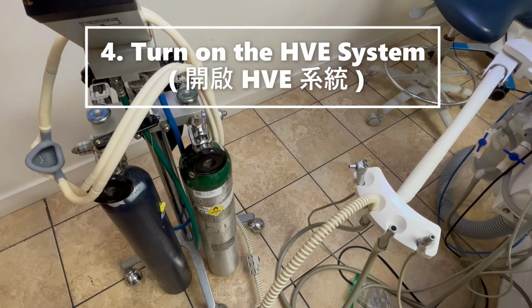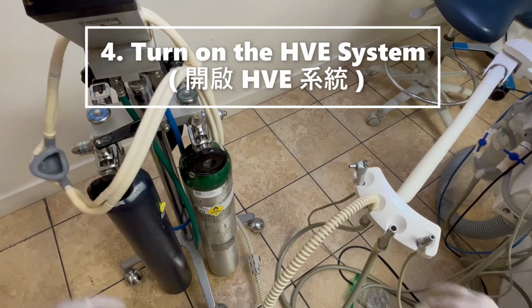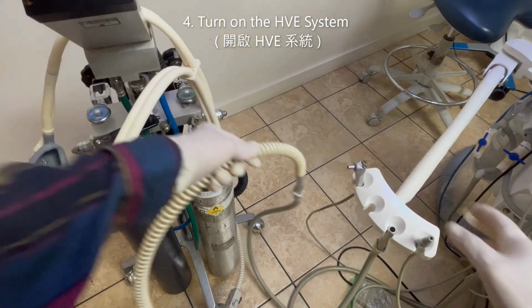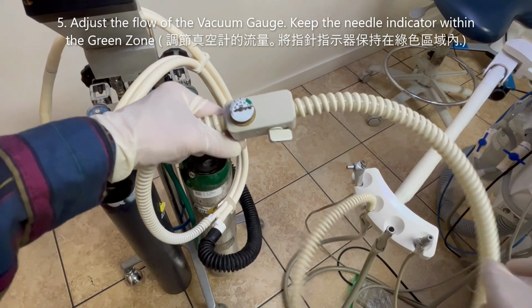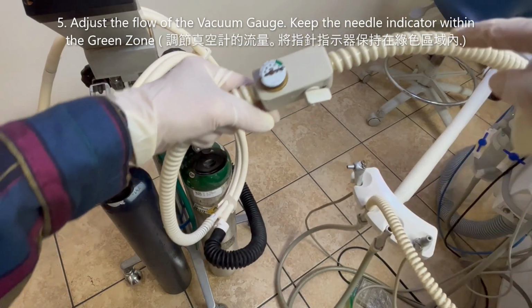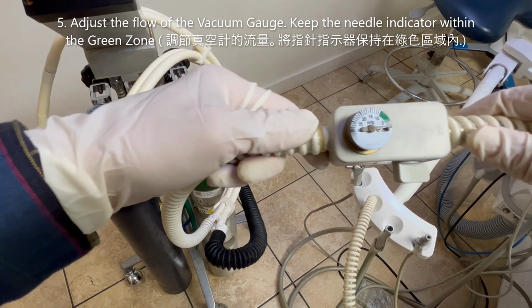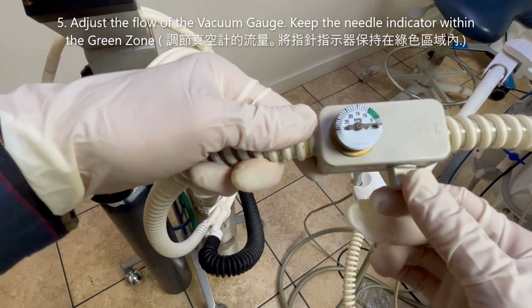Once you finish connecting the exhaust systems and the nose piece, when you are ready, turn on the high volume evacuation system. Once you turn on the high volume suction, this tubing has a gauge. It tells you the right amount of flow of the evacuation system.